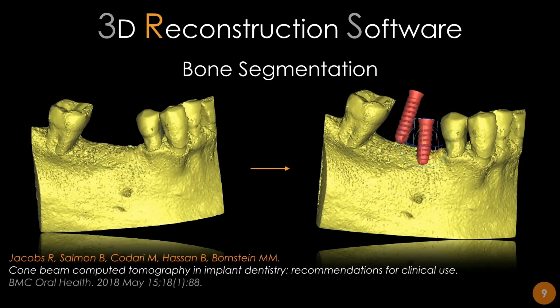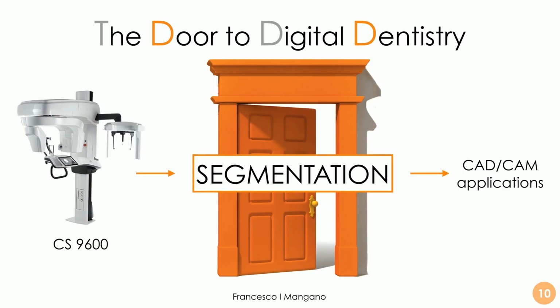But of course, bone segmentation is a little bit more tricky, a little bit more difficult than the simple visualization of the 3D structure. It is not the only way to use the DICOM file properly, because the DICOM file can be used by computer-assisted design software also for guided surgery, and it is the most important application to date for surgery. Implant surgery and guided implantology is the most important application of DICOM file, I think, in the field of dentistry and dental surgery.